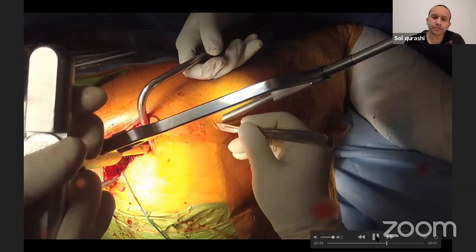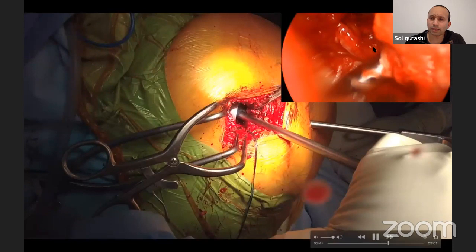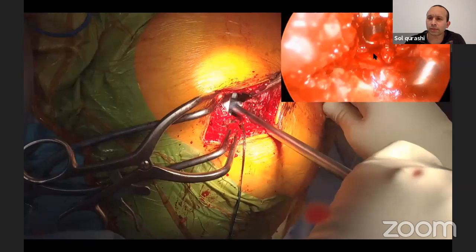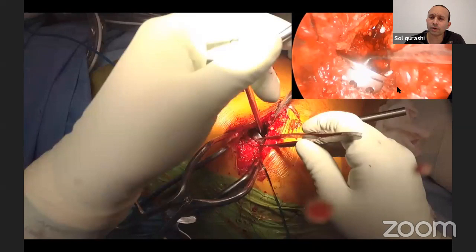So there's just in the skin, you put the blunt trocar in. And as you can see on the top right, it's coming out right next to the calcar. You can see the femoral broach and the calcar, and it comes out right posterior to it. There's the femoral calcar, and the cannula comes out right next to it. So once that's in, you start putting in the reamers until you're happy with the size you've got.